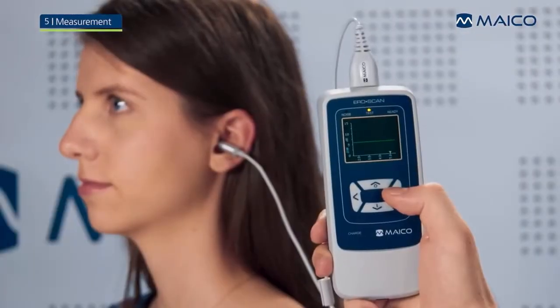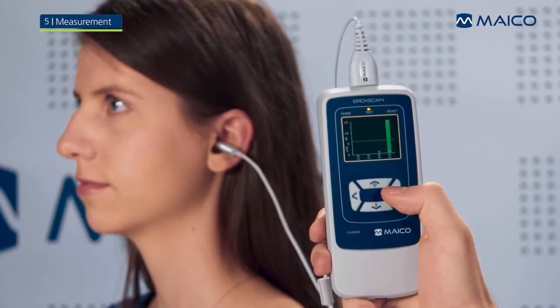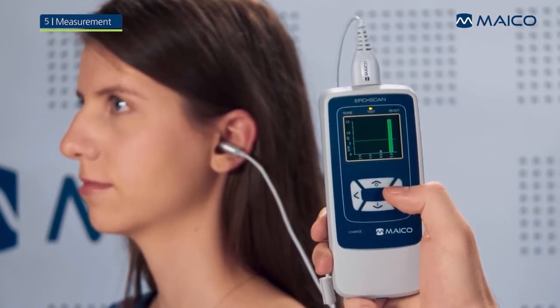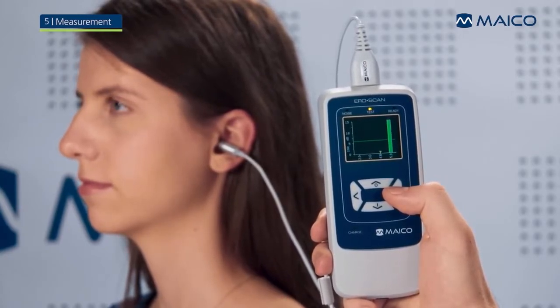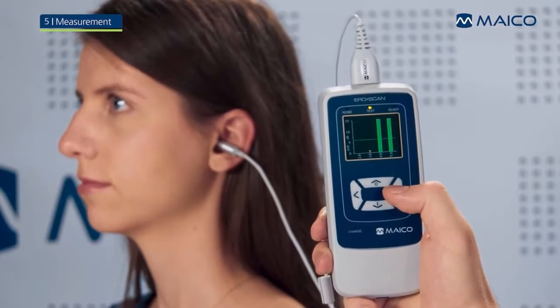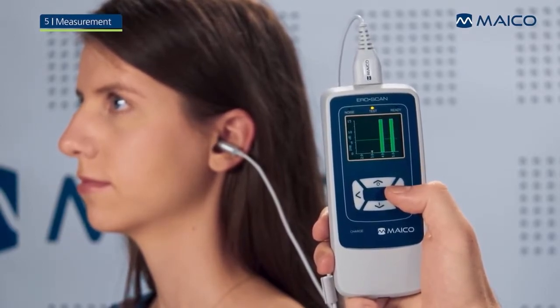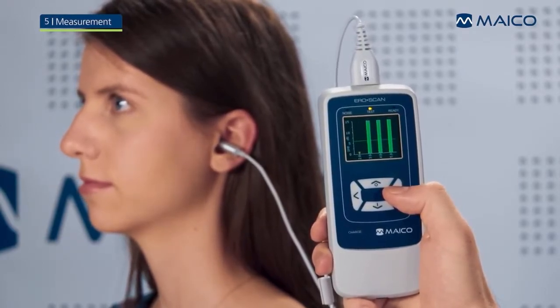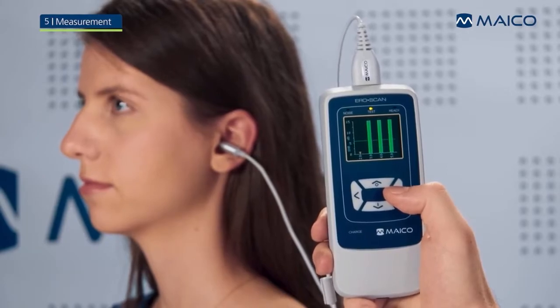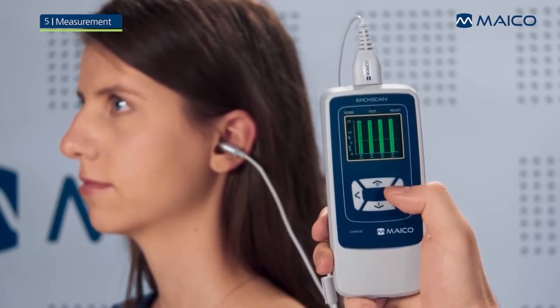Every frequency will be tested one after another. The display will show the signal-to-noise ratio for every test frequency. A green bar indicates that the pass criterion for the specific frequency was reached. The display and sequence of the measurement will depend on your specific settings.